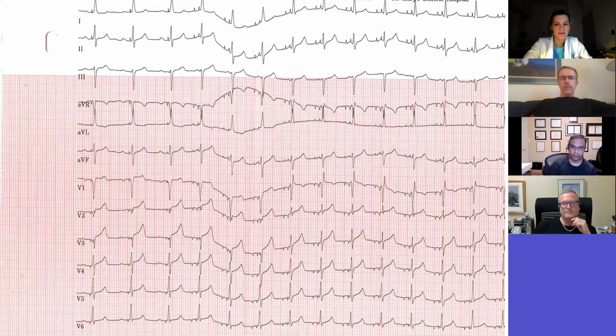Anyway, to me, this scenario is the good news one, where the lower voltage is giving you the better QRS. You worry less about follow up over time. But I agree with Jackie. If the lead isn't perfectly placed in the left bundle, sometimes you get a nice QRS with a higher voltage. But when you do a threshold, if no one's looking at the ECG, you might end up pacing at a lower voltage and end up with a wide QRS because you're capturing the septum without any of the conduction system.